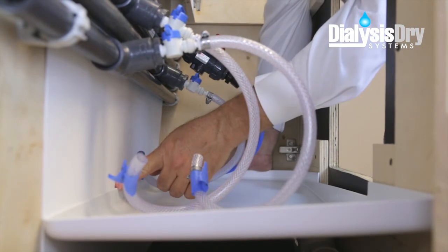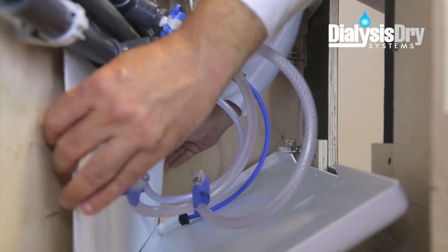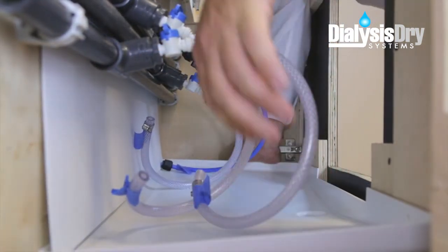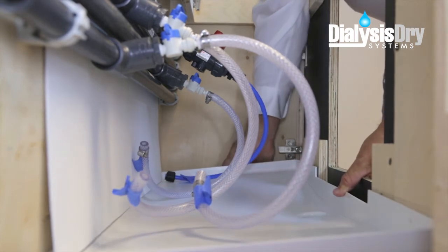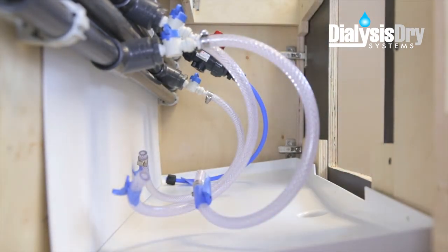You'll see that the tray matches the depth of the cabinet interior. Slide the lip on the back side of the tray underneath and behind the reinforced panel. This will assure proper drainage from any possible leaks or condensation from the existing distribution pipes on the back wall.